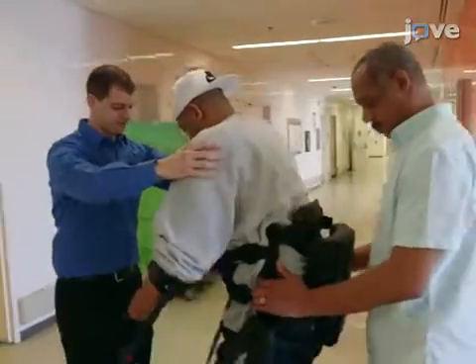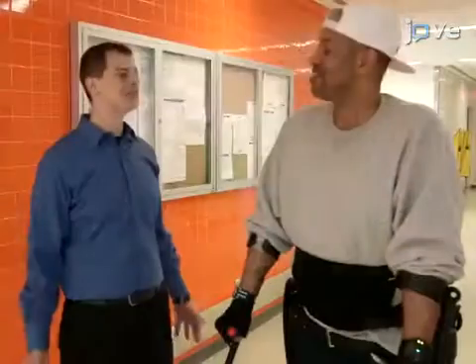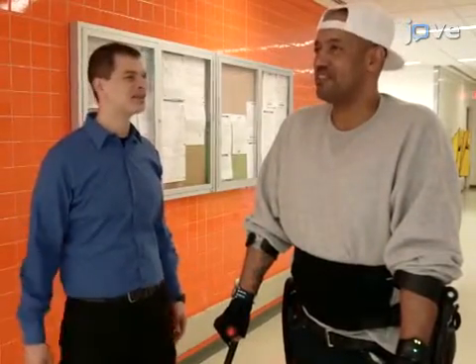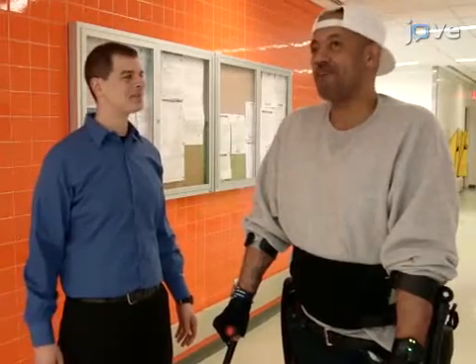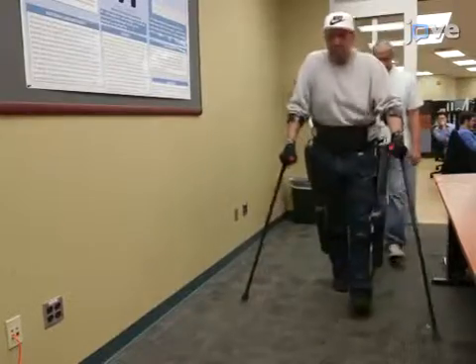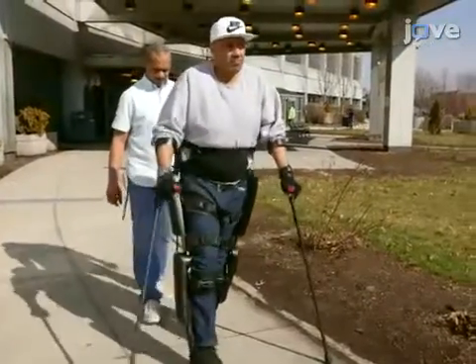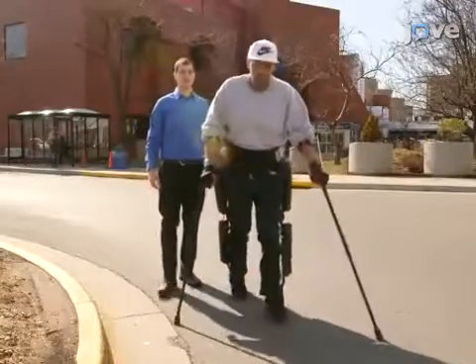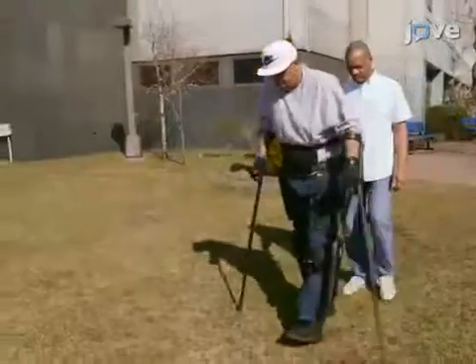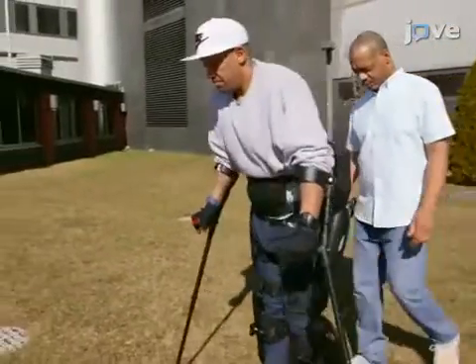Correct the participant as they perform the proper weight shifting while walking. Describe a list of mobility skills to the participant that will be practiced as part of the training. Incorporate different walking surfaces during the training session, such as carpet, concrete, asphalt, and grass, so that the participant is able to practice walking on a variety of surfaces with the exoskeleton.